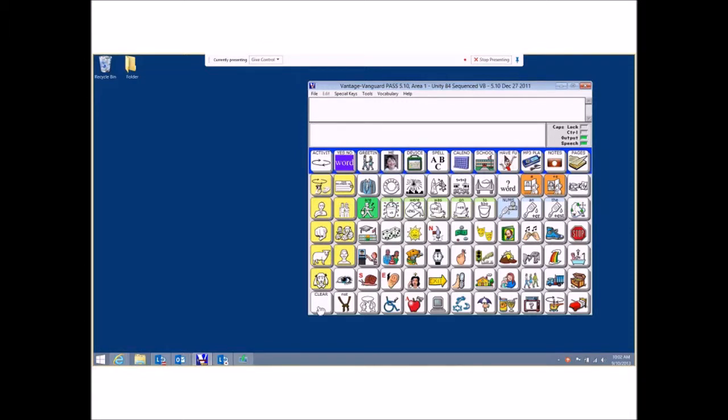Another thing that you might see Jake doing is up here on the activity row, there's a lot of pre-programmed things. Underneath the me button specifically is where you'll find a lot of things like my name is, I live here, my phone number, my birthday. So I know last year a police officer came into class and asked, does everybody know their phone number? Jake absolutely could have answered that just by going to the me button off the activity row and then selecting my phone number.